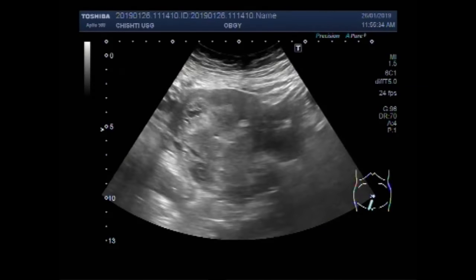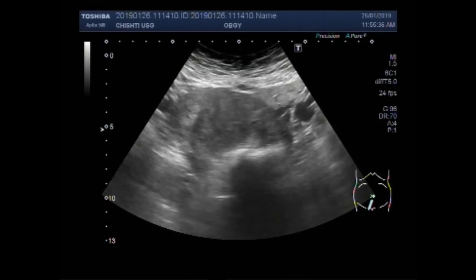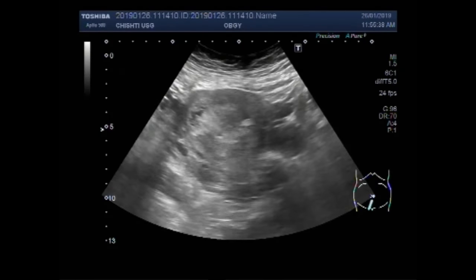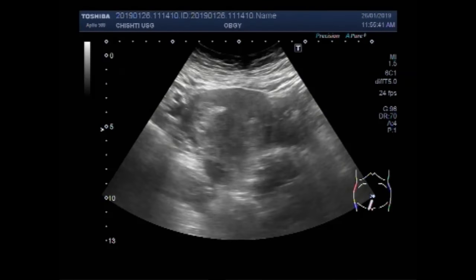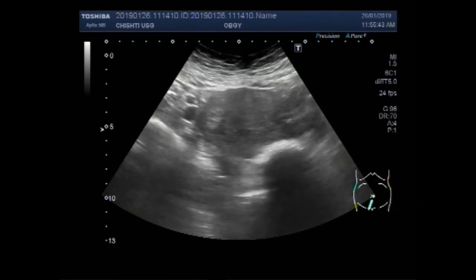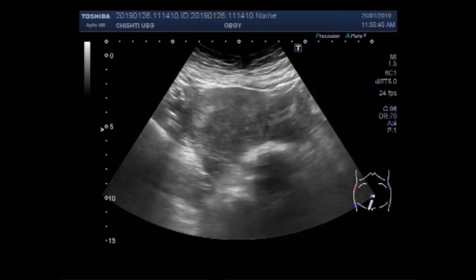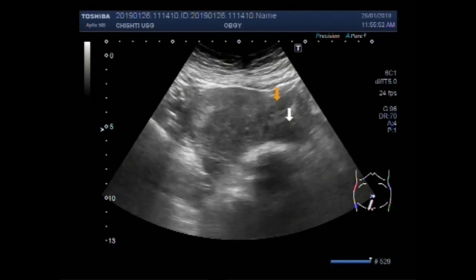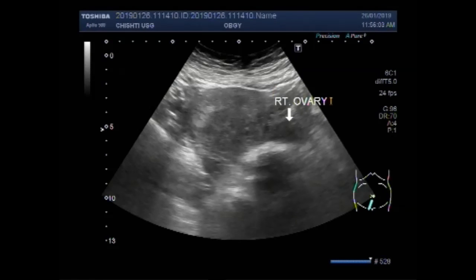There is no fetal pole in the gestational sac. You can see that both the ovaries are visible — this is the right ovary and this one is the left ovary.